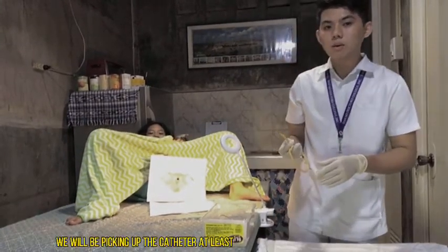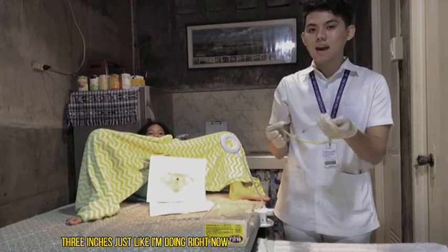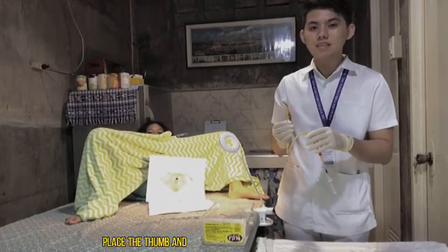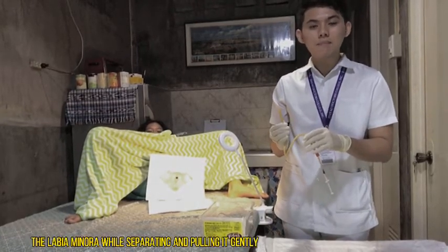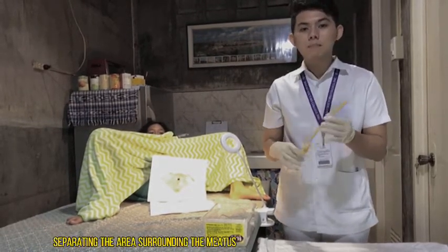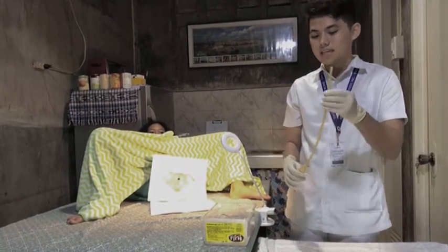So next, we will be picking up the catheter at least 3 inches, just like I'm doing right now, from the tip of the thumb by using your dominant hand. After that, place the thumb and the finger with your non-dominant hand between the labia minora while separating and pulling it gently. This is important because separating the area surrounding the meatus provides visibility.